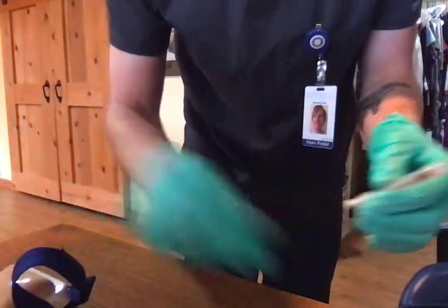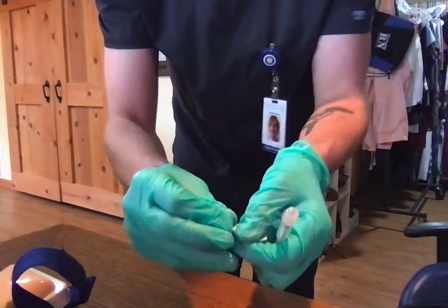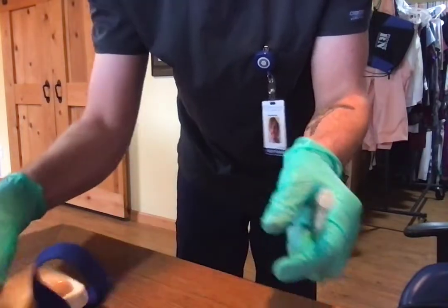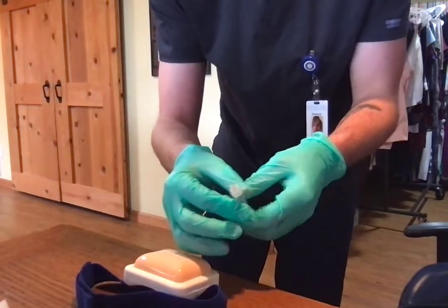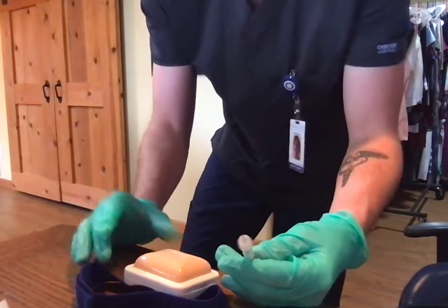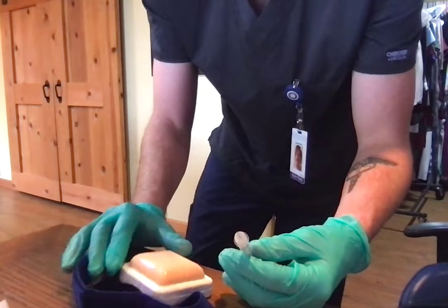And then I'm also going to use some alcohol on my patient. Make sure that's nice and dry. I'm going to insert this at 15 degrees with the bevel up.